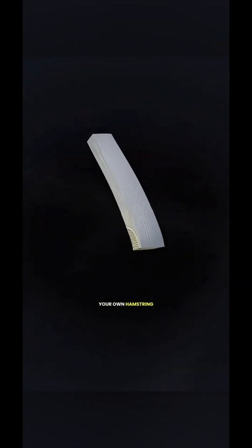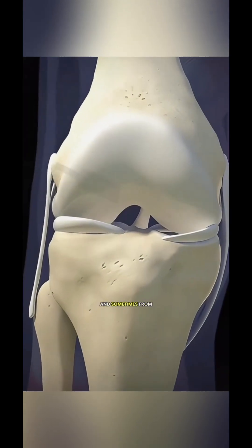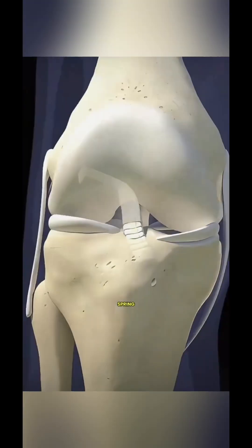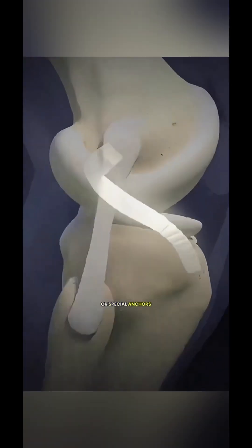The damaged ligament is carefully removed and replaced with a new bridge, usually taken from your own hamstring or the tendon near your kneecap, and sometimes from a donor. The new ligament is positioned exactly where the old one was, like swapping in a perfectly cut spring, and then secured with small screws or special anchors.